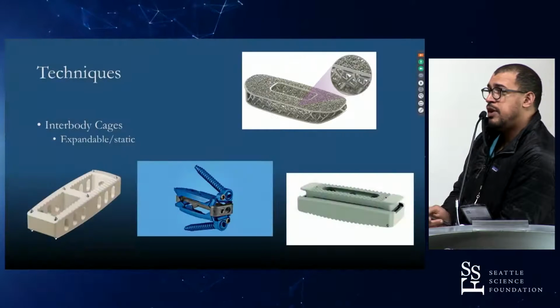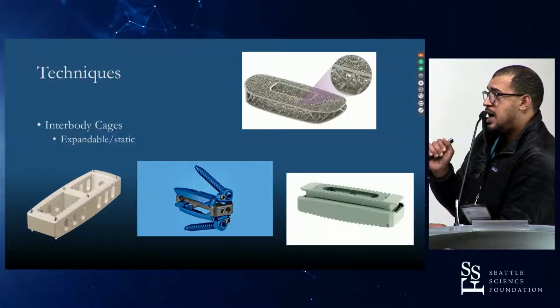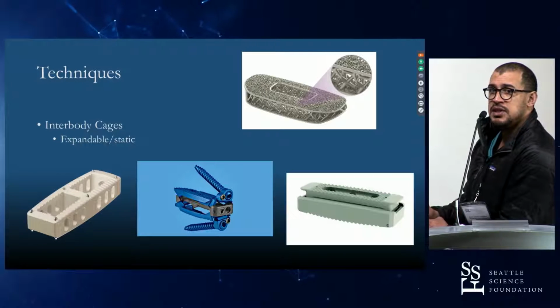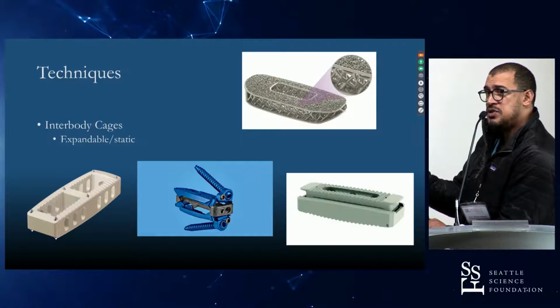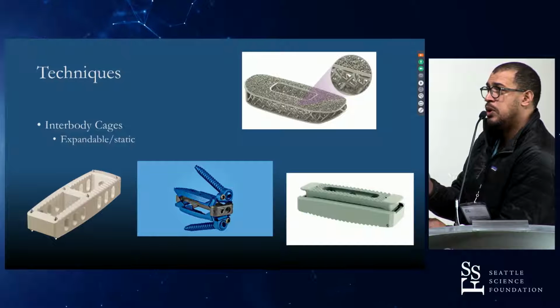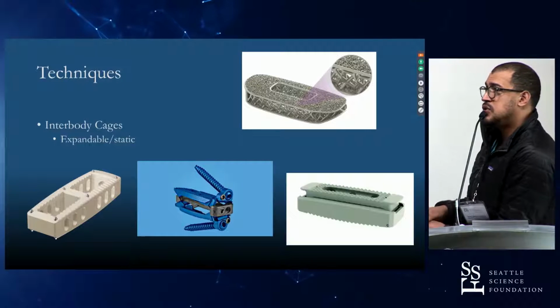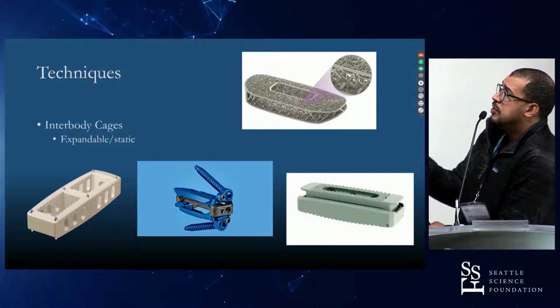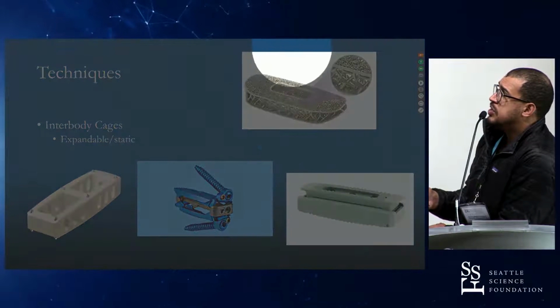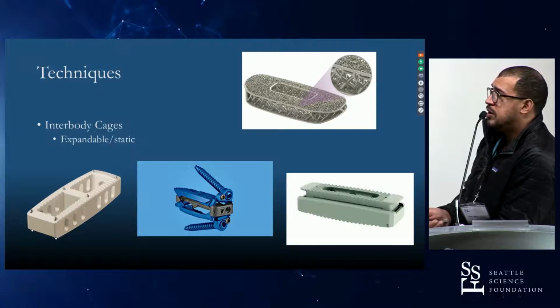If you do find that that's very unstable when you're putting it in, you can actually, I was asking Rod about using the lateral, you may have the starting point, everything's good, and as you start to hammer it down, it can start to migrate forward. So if it's very loose, if you do a complete anterior longitudinal ligament release, one of these cages without fixation can actually migrate forward, so something that you want to be aware of.